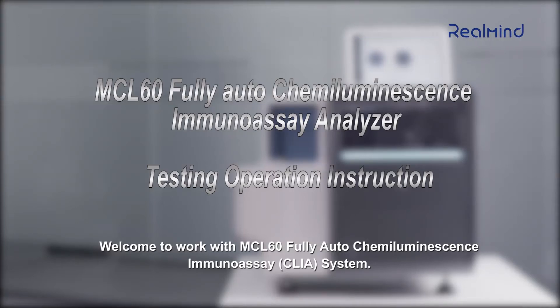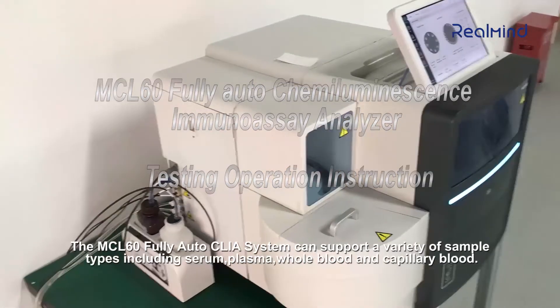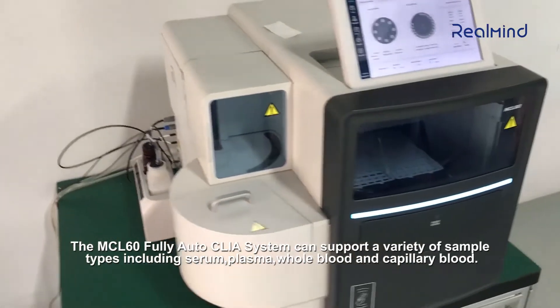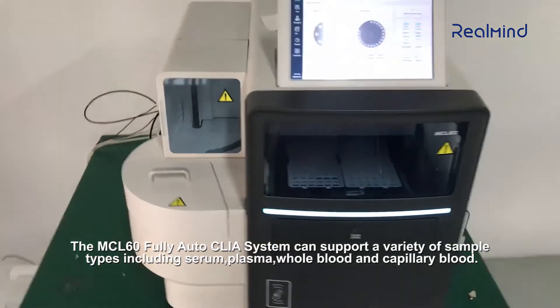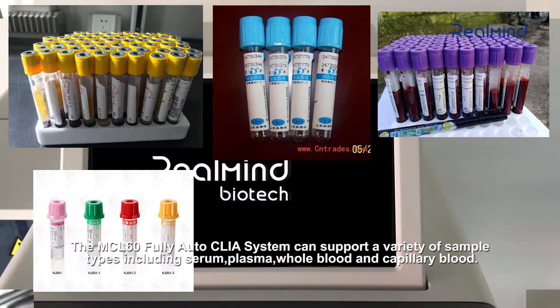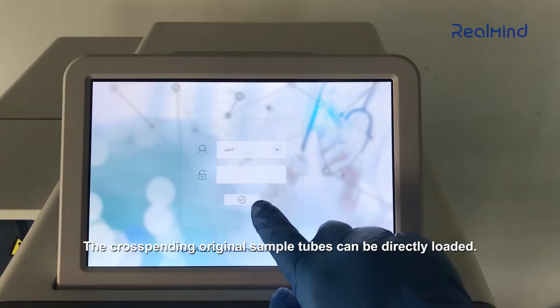Welcome to the MCL60 fully auto chemiluminescence immunoassay system. The MCL60 fully auto CLIA system can support a variety of sample types, including serum, plasma, whole blood, and capillary blood. The corresponding original sample tubes can be directly loaded.